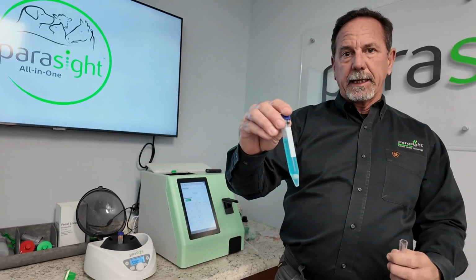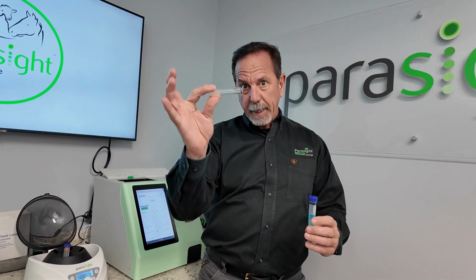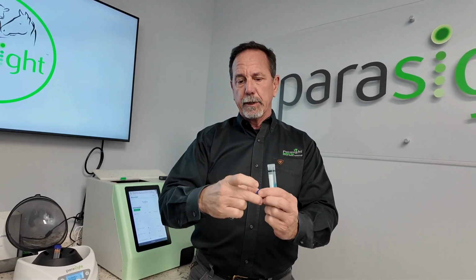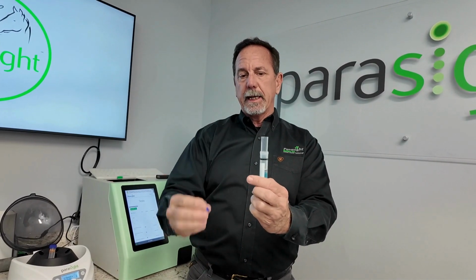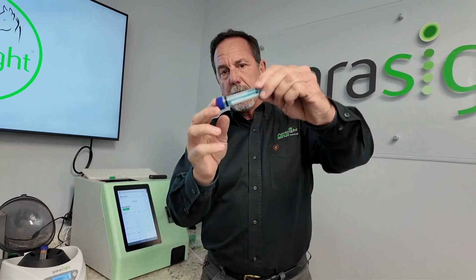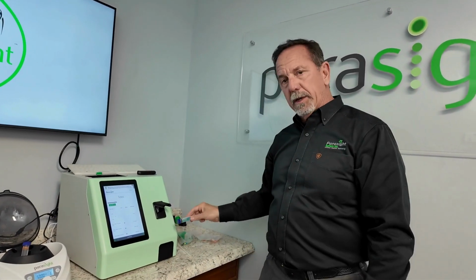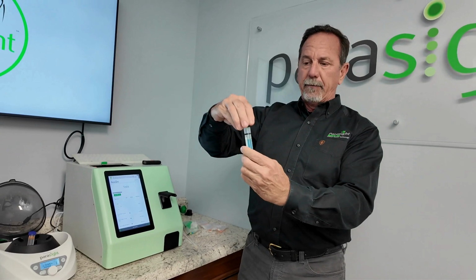Centrifuge is done, you'll take that out, and even with the fecal loop sample, you still need to put the egg separator in. What you're going to do is open that up, place that in there, take the top, press down, and close it. And again, what that does is allows you to pour the right amount directly into the unit when we're using that. So essentially, it prevents that from happening.